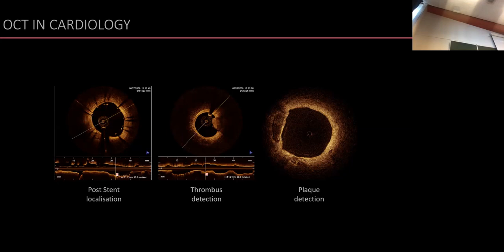One of the treatments, if you have an artery that is filled with either slushy material, or a thrombus or a stenosis, really closure of an artery, what you can do is bring in a balloon, bring in a stent to open everything up. The stenting is done by an interventional cardiologist. And the whole idea is you bring in this little, what we call chicken wire, and you blow everything up, and everything opens up again. And I'll show an example later.